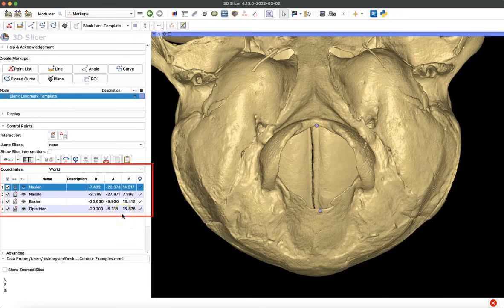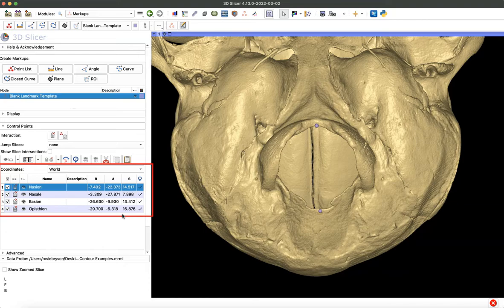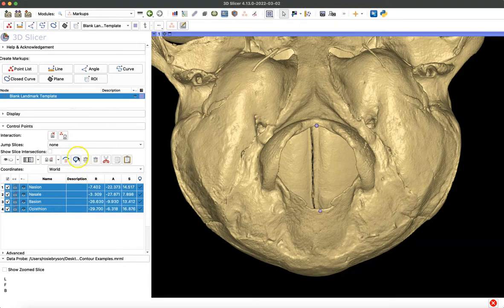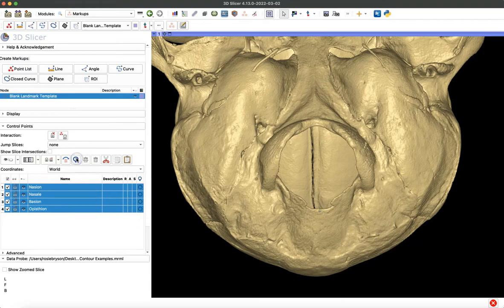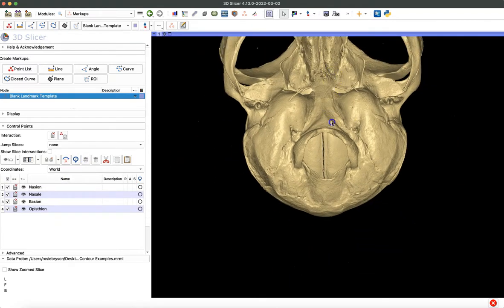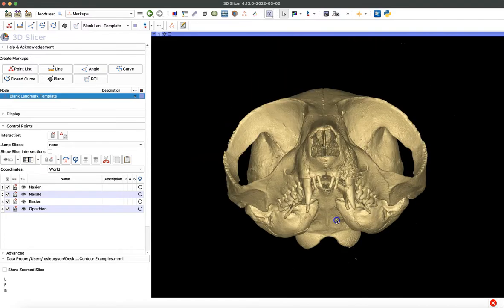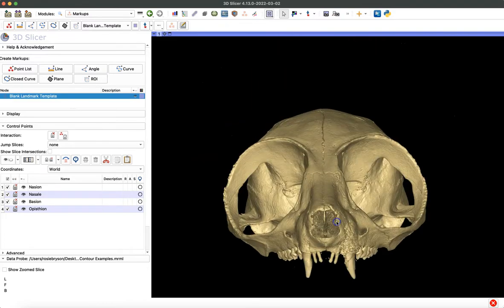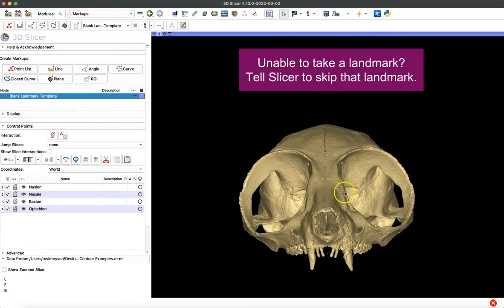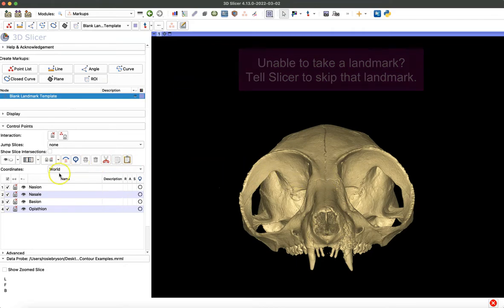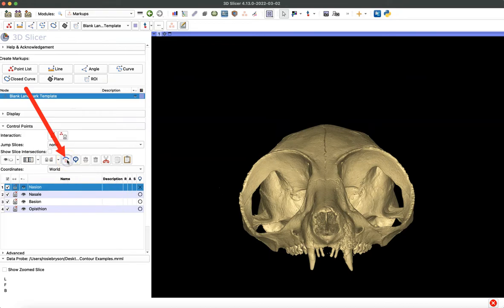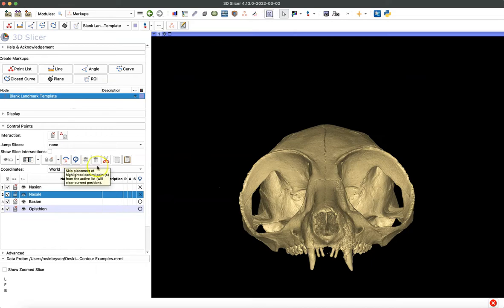Before we finish this video, I have one last tip to show you. I'm going to erase all these coordinate points and clear these out without deleting my actual list. Then I'm going to rotate the skull back to look at the anterior view again, at the face of the skull. If you're ever missing material from your specimen and can't take one of your landmarks, for example, if we were missing the nasal area of the specimen, you can use the skip placement icon to skip nasion and nasale or whatever landmark you weren't able to take on your specimen.